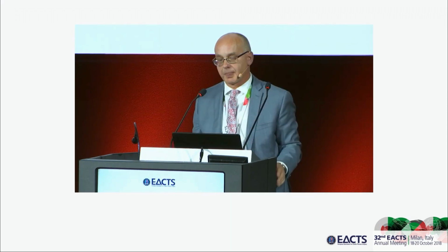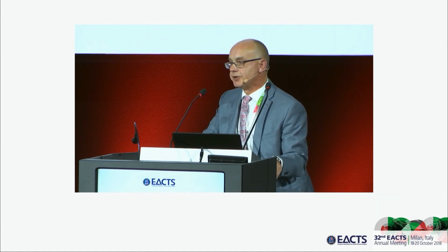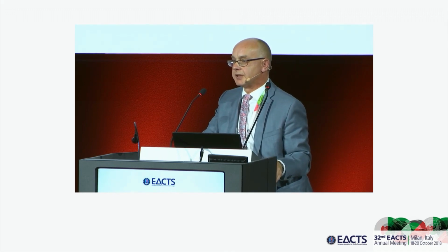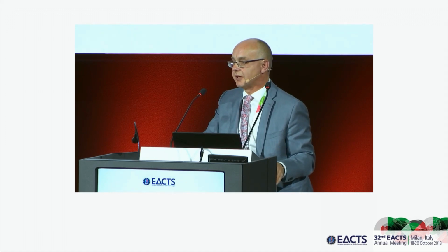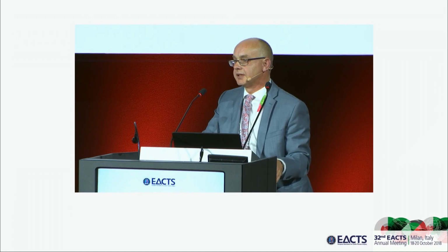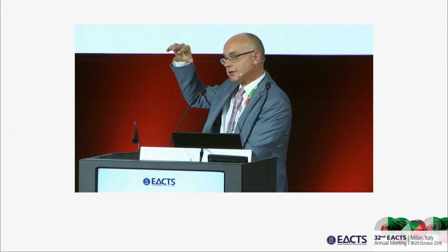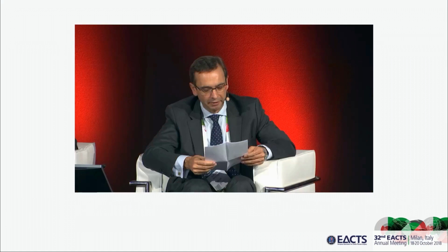And for sizing, we rely on one single measurement of the aortic annulus. So let's say if you have an aortic annulus of 28, 29, I choose a Valsalva graft of 28, and for the ring, I always downsize by one size, so I would put 27. Then I have... sorry, we have to. We are running behind the schedule.